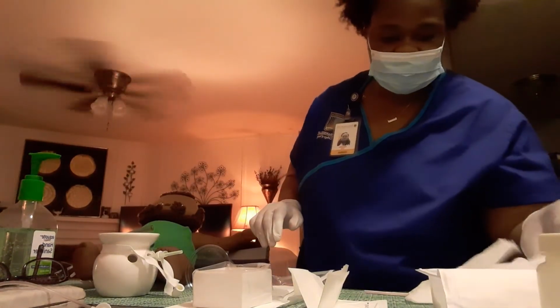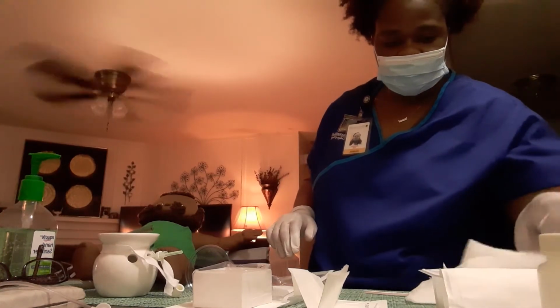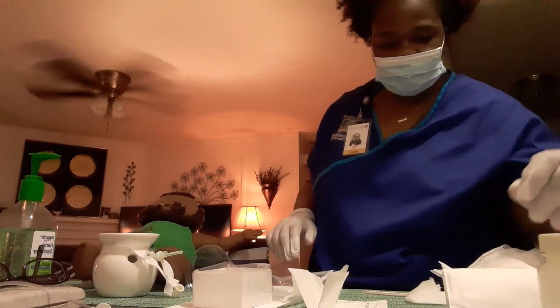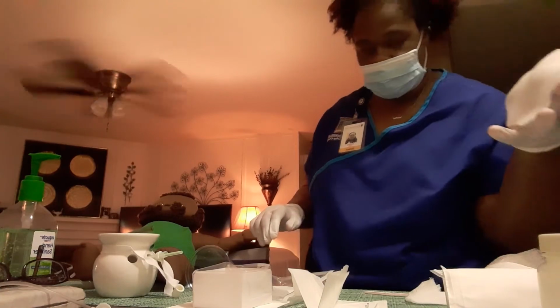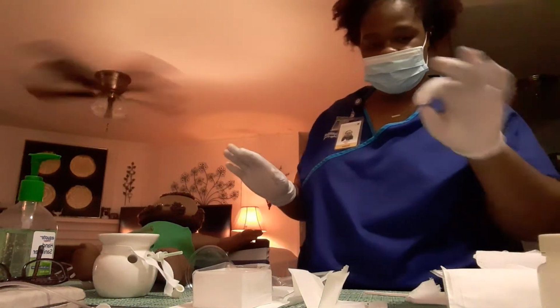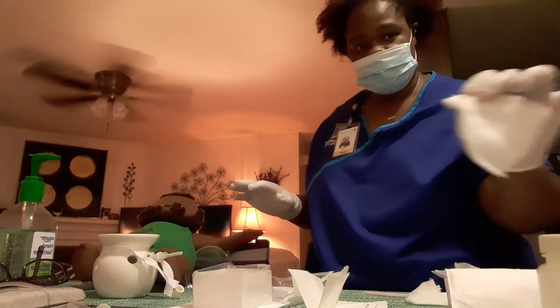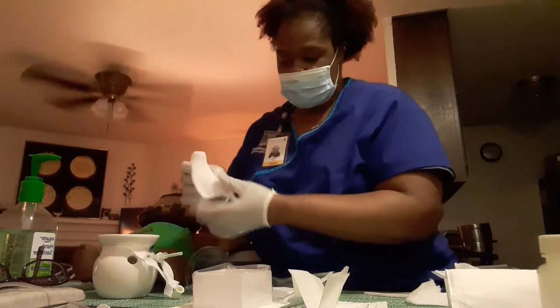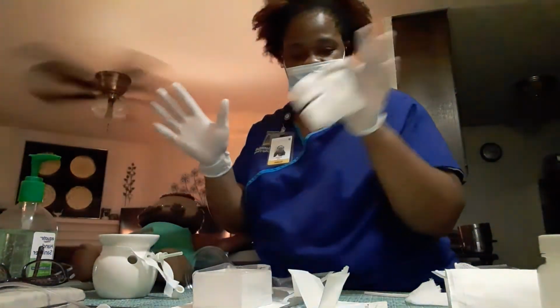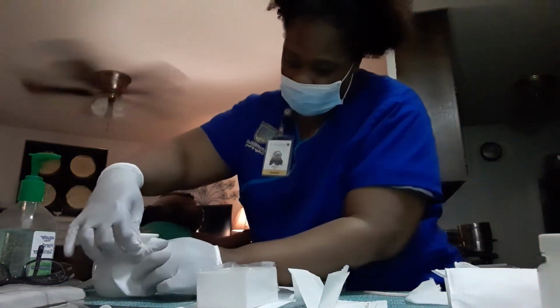Stoma looks good. And now I can take a gauze as needed and pat dry top, and then pat dry the bottom. And now I can place a new gauze. And at this point, I'm done being sterile, so I can't touch everything. So I will put in a new gauze.